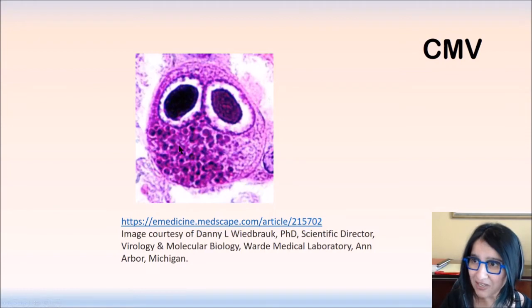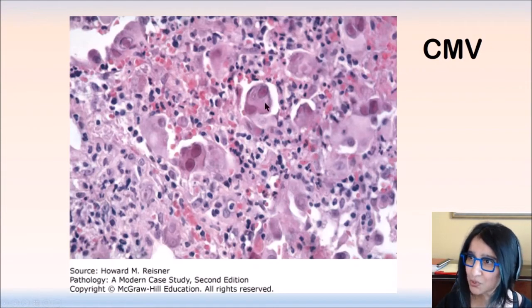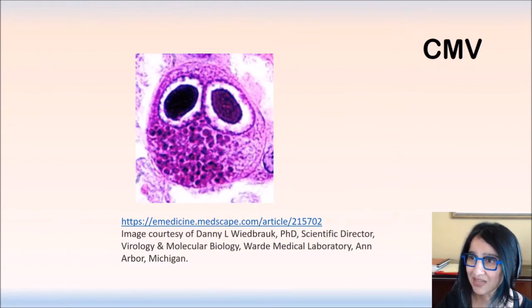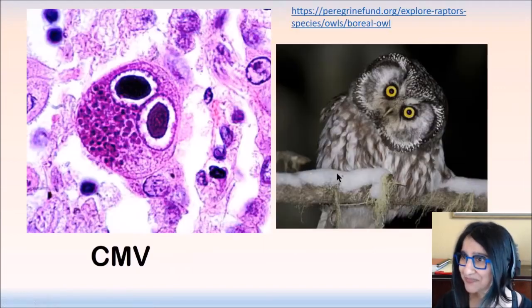If you go back and look at the cells that were affected, they're popping out not just because the nucleus is affected, it's because the cytoplasm is affected. That's why these cells were so easy to identify, because everything about them is huge. Big nucleus, big cytoplasm. And this is why, because we have not only the nuclear viral factory expanding here and creating that inclusion, we also have all these viral proteins collecting in the cytoplasm. So that is very typical of CMV.